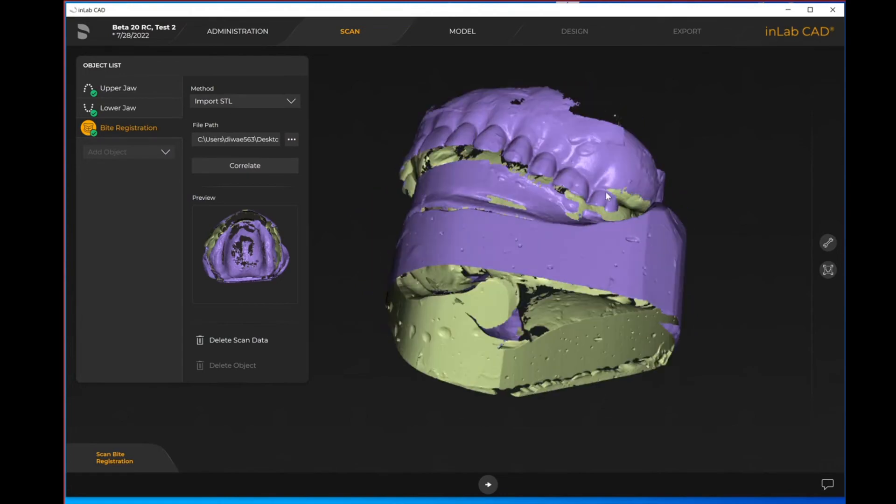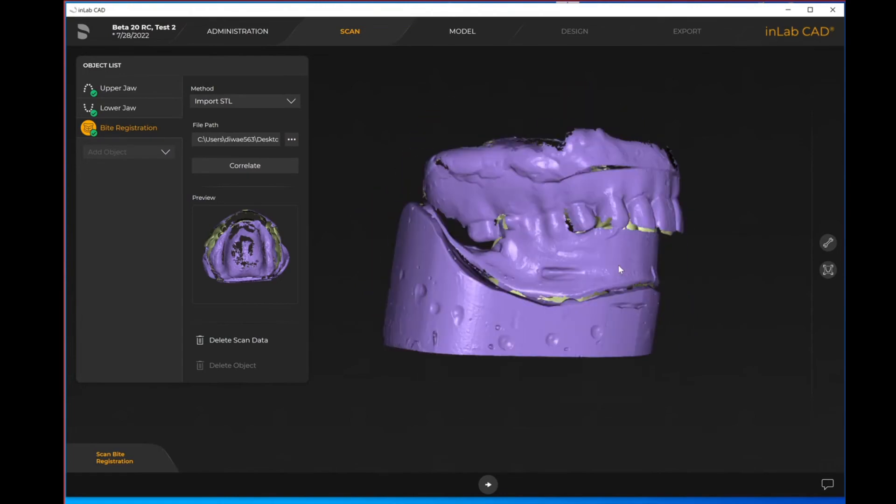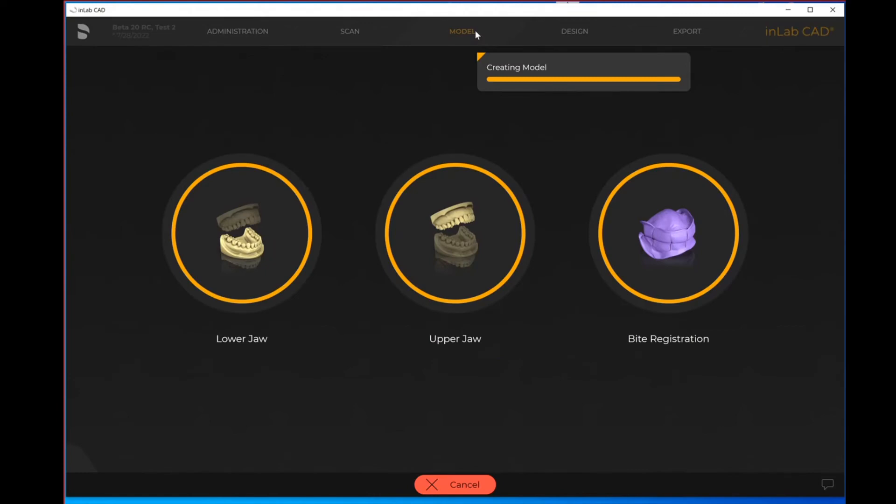As soon as we have our imported items, you'll be able to move forward as needed. I'm going to move forward into my model step. At this point in time if I was actually doing my designs I would carry on with my denture design, however I have a separate video for designing dentures which you can check out on our YouTube page.